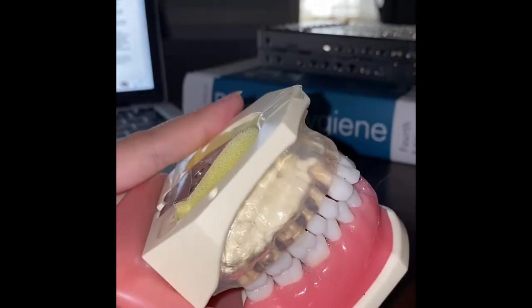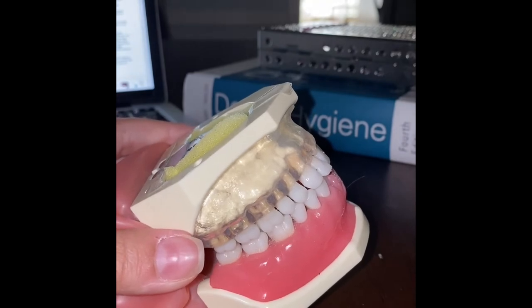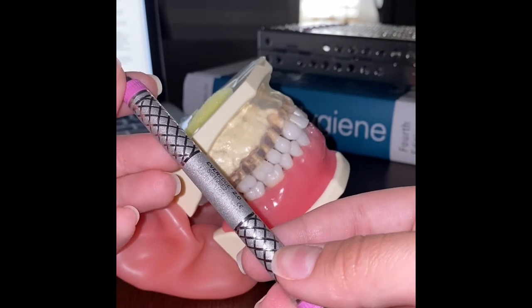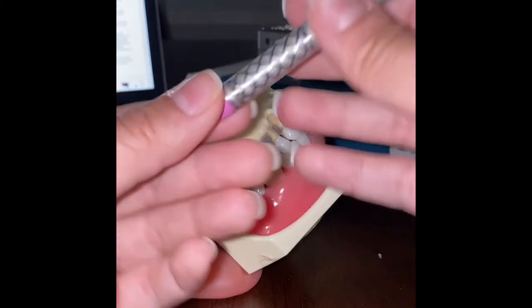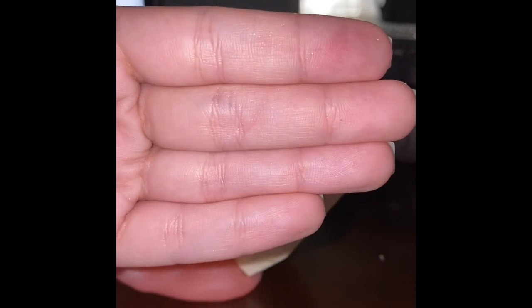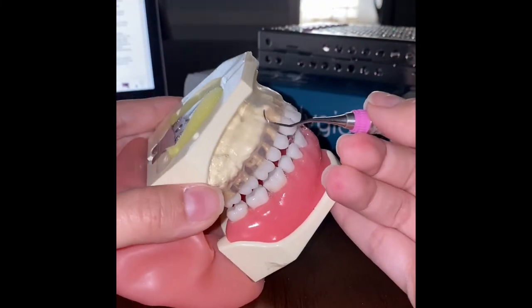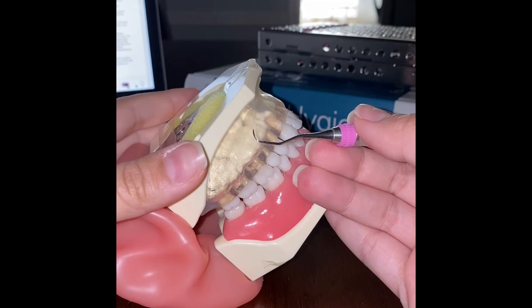The Gracie 1-2 is an area-specific curette used on all anterior surfaces, canine to canine. The Gracie curette has one cutting edge, unlike the universal which has two. The face of the blade is at a 70-degree angle, and the terminal shank is parallel to the long axis of the tooth. It also has a rounded toe.